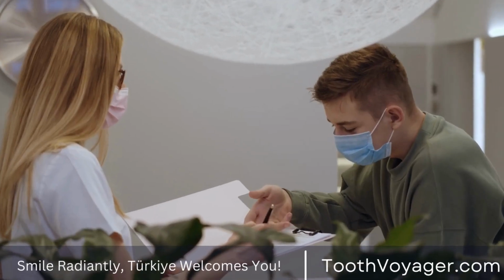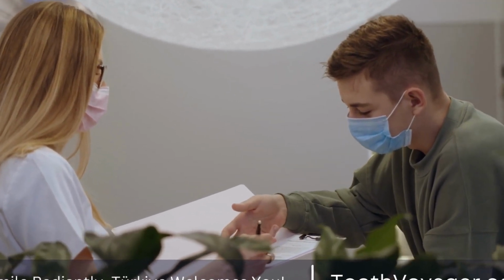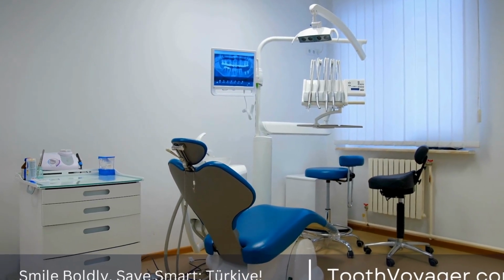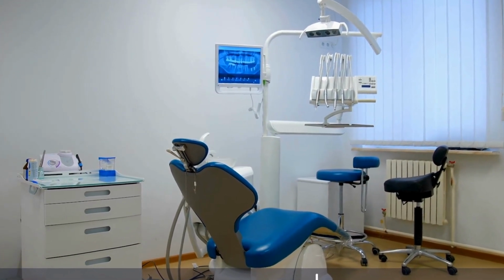A frame made of metal is put over the jawbone and prosthetic teeth are connected with the framework. Subperiosteal implants can be a great alternative for those who are not suitable for conventional implants because of the loss of bone or any other issue.